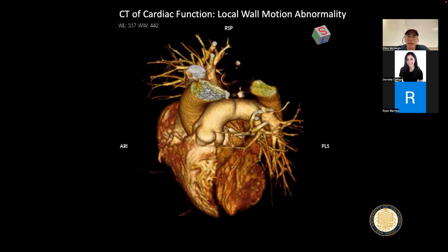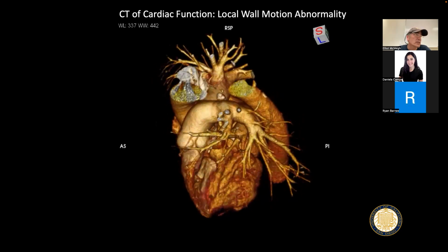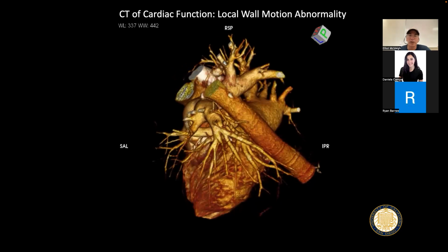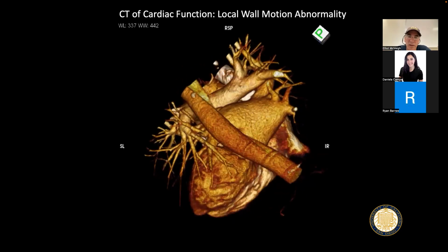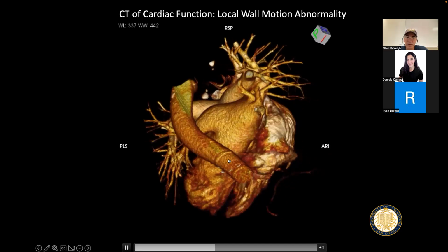To this point, if you look at atrial function, it's mostly done with echo, either transesophageal echo or with MRI. In MRI, you do this in multiple slices. You'll walk through them, and we'll see how you do cardiac MRI very shortly, okay? So there's tons of functional information here.